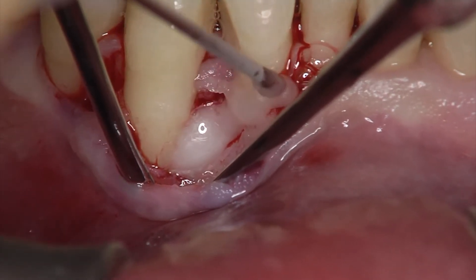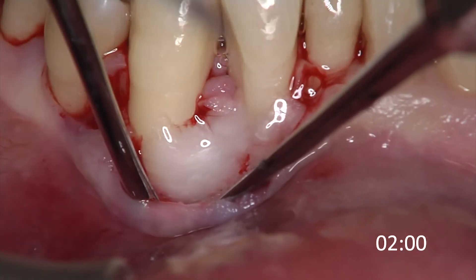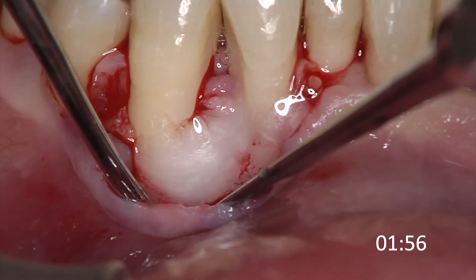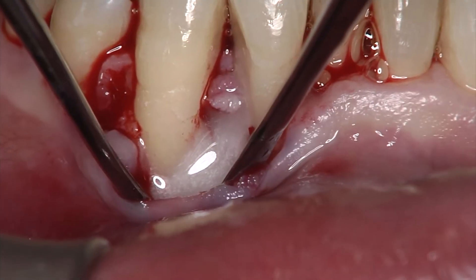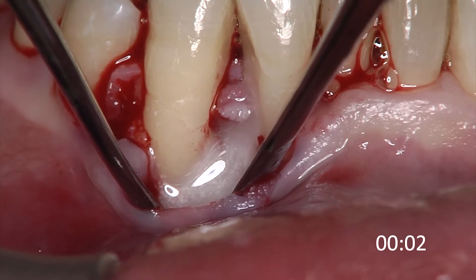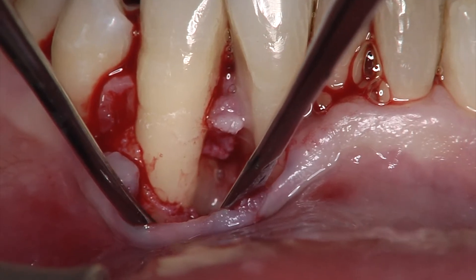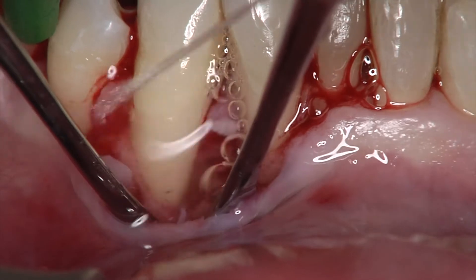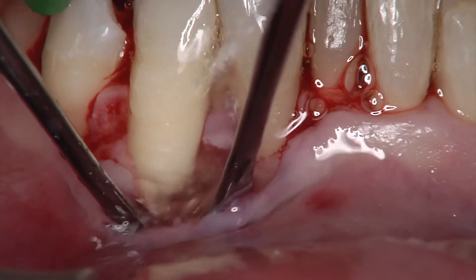The conditioning of the root surface is carried out by applying Straumann PREF gel, EDTA, for two minutes. After conditioning, Straumann PREF gel is removed by thoroughly irrigating the surgical area with sterile saline.